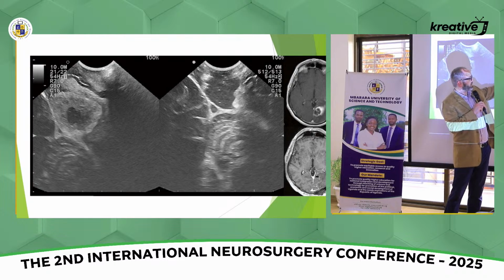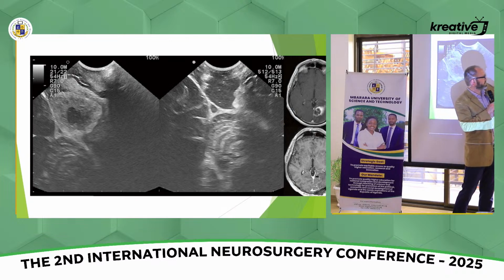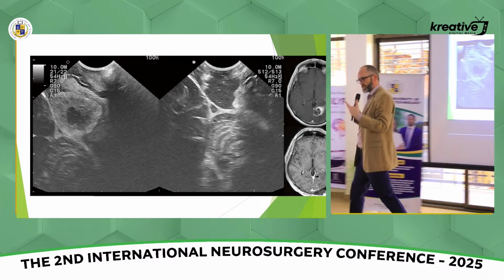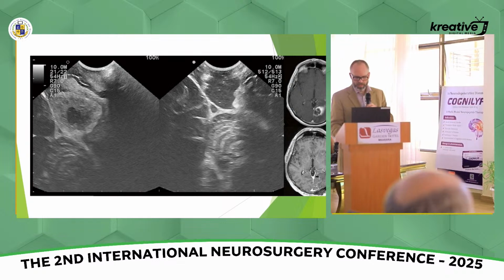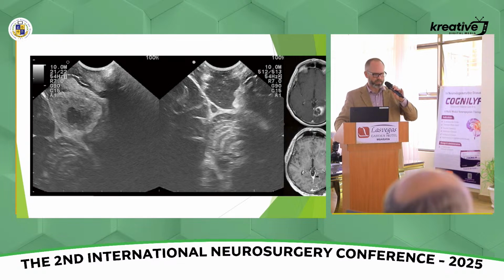We just have, through that fluid cavity, a very bright meninges and tissue beyond. All right, this is that edema that we saw at the beginning, which we know is not the tumor, right? And up to the right just shows the preoperative and postoperative scan showing gross total resection.